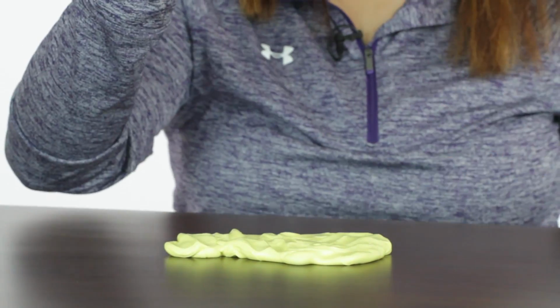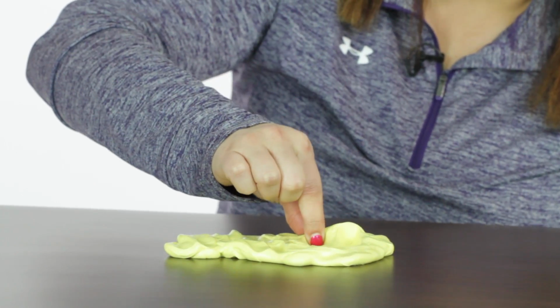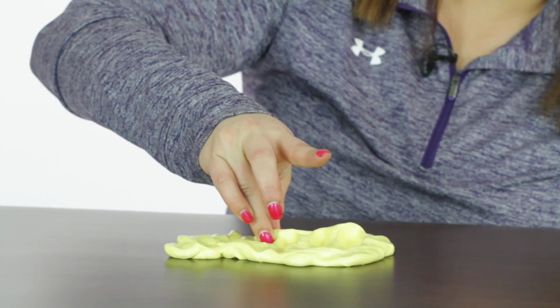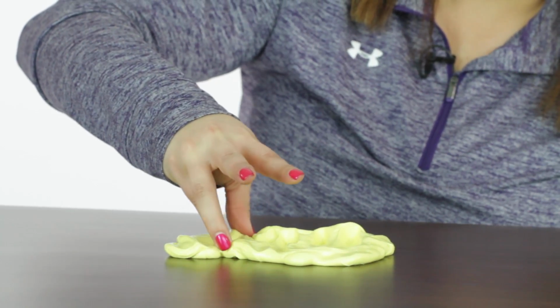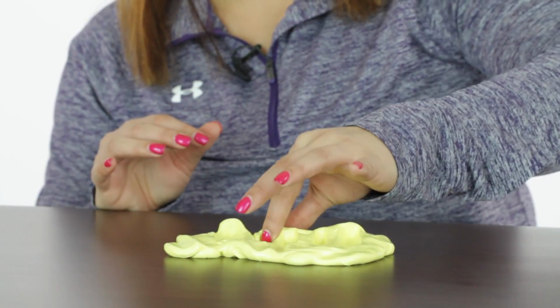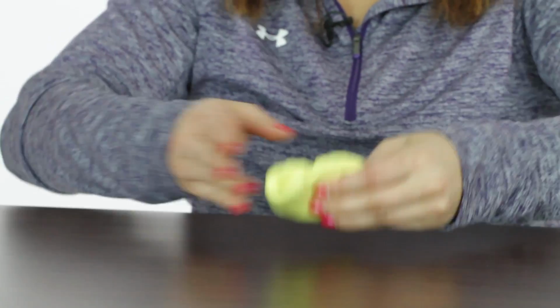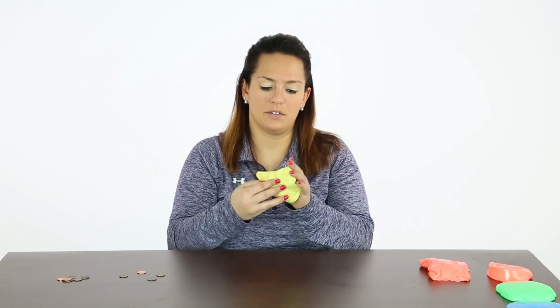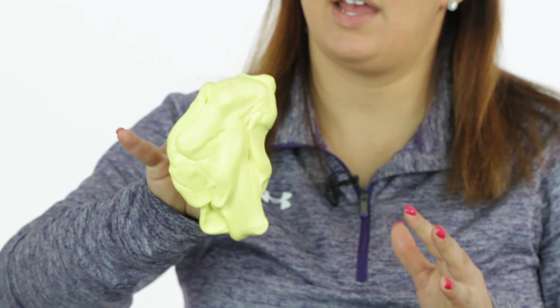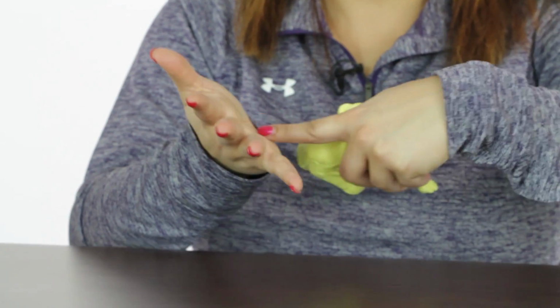Something else you can do with just your pincher fingers is you can practice making mountains, using all fingers. Going from your pointer finger to your pinky finger kind of becomes more difficult with each hand. You can put the putty over all fingers, kind of push it on there and practice spreading out for some of the muscles on the insides of your hand.